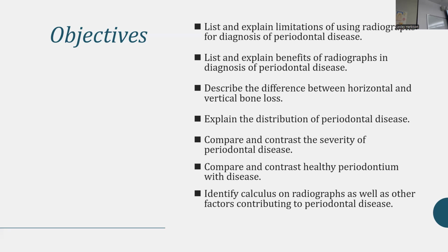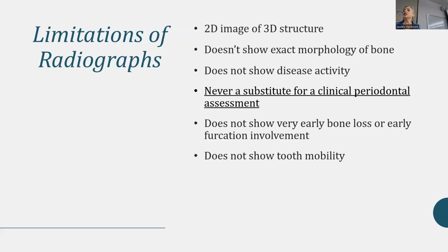So identify calculus on radiographs as well as other factors contributing to periodontal disease. So we'll talk about calculus and overhanging restorations and things like that. So, the limitations of radiographs.